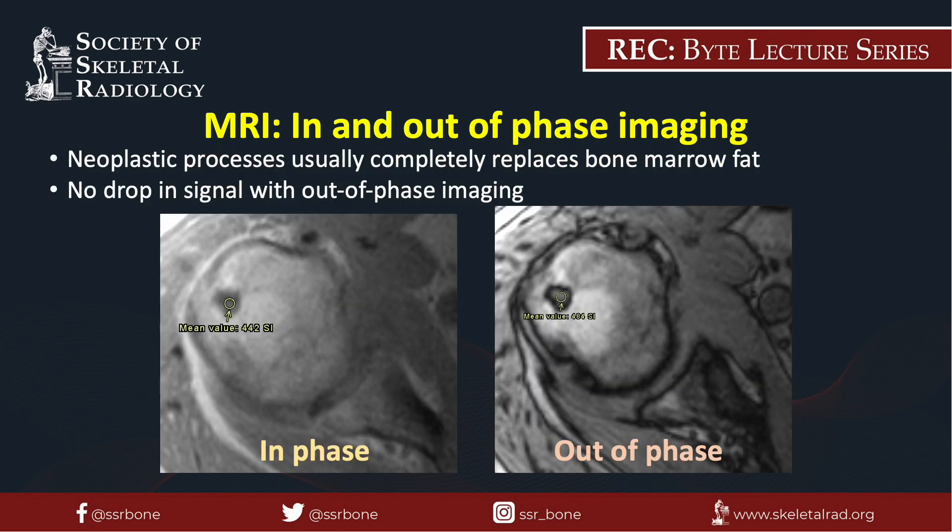On this MRI of the shoulder, there is a small lesion within the humeral head that does not drop in signal on the out-of-phase image relative to the in-phase image. This patient has known metastatic lung cancer to the bone and this lesion is presumed to be a metastasis.